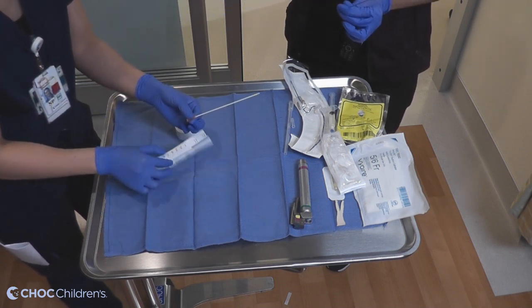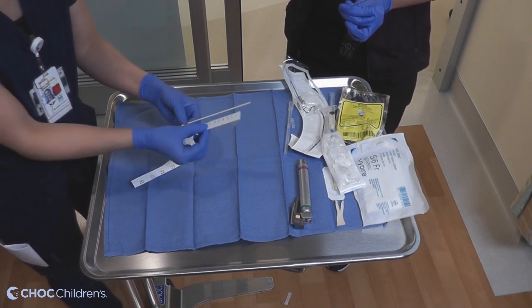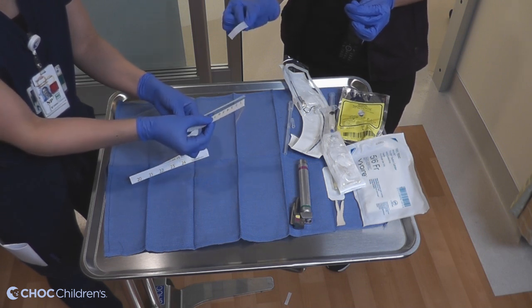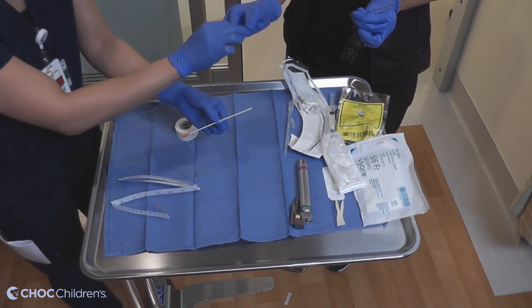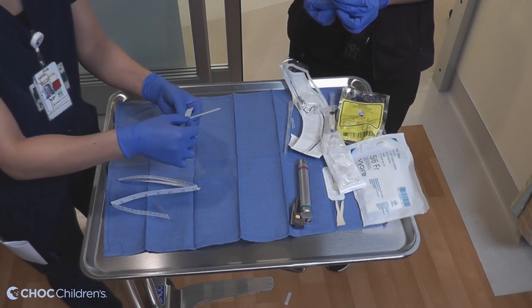To determine the length, you will use the measurement of 6 centimeters plus the weight of the baby in kilograms. In this example, we're using 1 kilogram as our weight, which makes our measurement 7 centimeters. You're going to place the tape on the catheter to mark the depth.